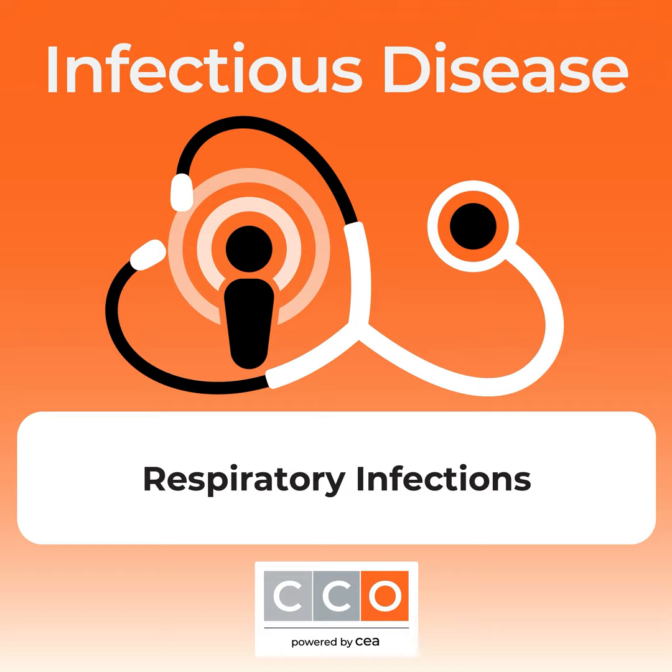If you don't detect Pseudomonas or other non-fermenters like Acinetobacter, you potentially could narrow away from anti-Pseudomonal beta-lactams, because if they don't have Pseudomonas molecularly on their BAL specimen, for example, maybe you don't need to cover that organism, even if you normally would cover that empirically. If you detect Klebsiella or E. coli with no resistance genes, you can be pretty comfortable that they don't have an ESBL producing organism or a carbapenemase producing organism, and you could potentially switch whatever you started empirically to a drug like ceftriaxone.